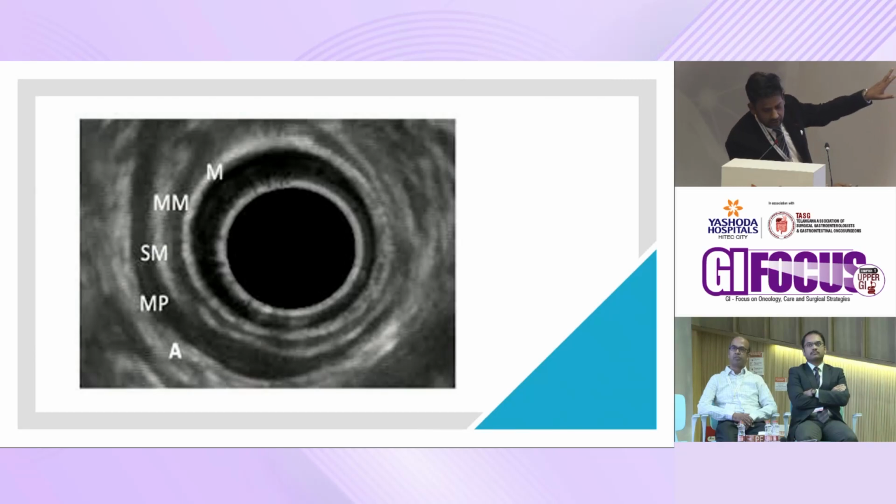If you look at these pictures, you see the white, black, white, black. So that's just like your floor that you have. You have concrete, you want to put cement on the top, and then you have marble on the top. So the mucosa, submucosa, the white structures, to make things easy for the people who do not know.